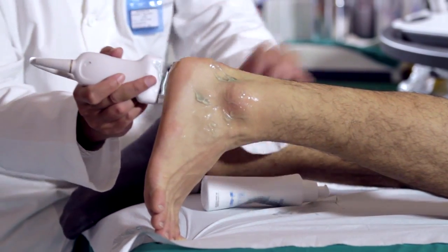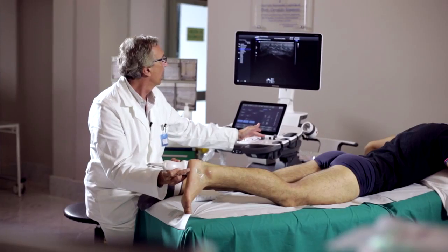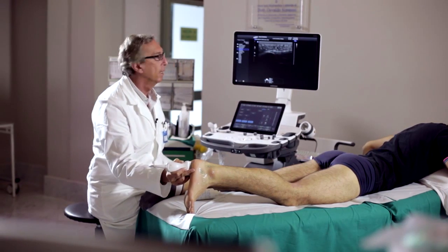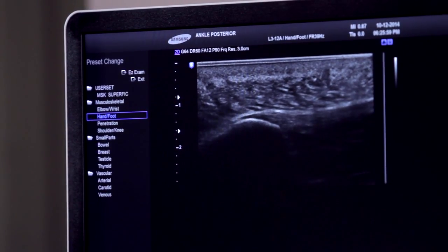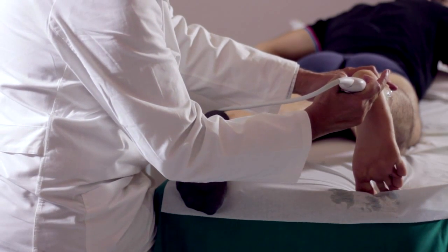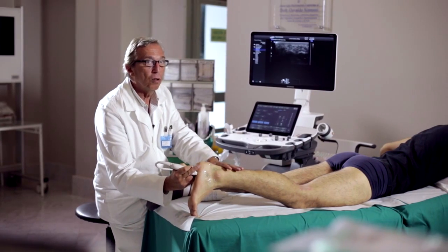The main scan is along the major axis at the level of its insertion. As you can see from the images, the normal appearance of the plantar fascia and its insertion at the calcaneus bone. This scan allows us to study very well this band on both the long axis and on the short axis in all of its length. With this last approach, the ultrasound examination of the ankle is complete.